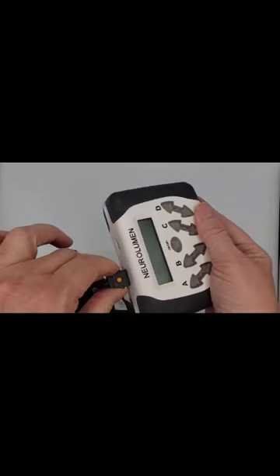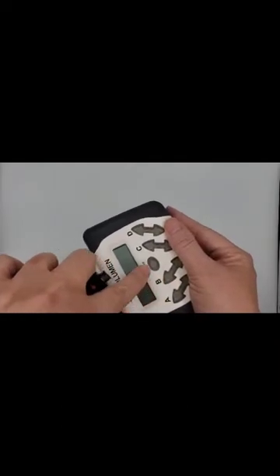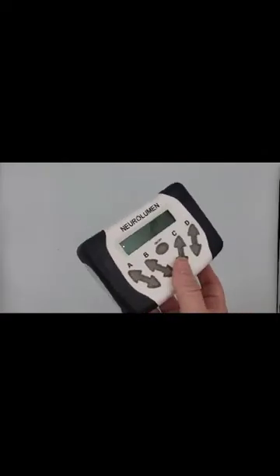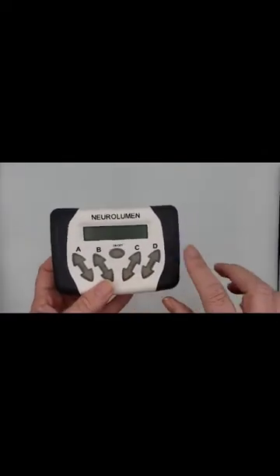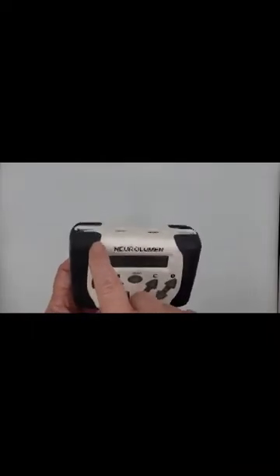The single treatment pad will use ports B and C, and the dual treatment pad will use ports A and D. Each port has an arrow for the electrical stimulation right underneath that port, so you know which port goes to which arrow.